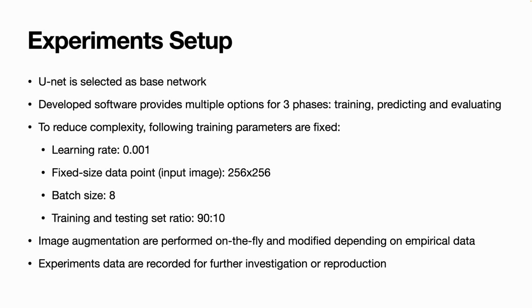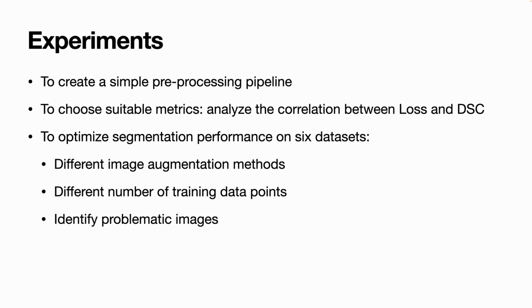Image augmentation is performed on the fly and then modified later depending on the empirical data. Experiment data are recorded for further investigation or reproduction, for further purposes like use in the production environment.